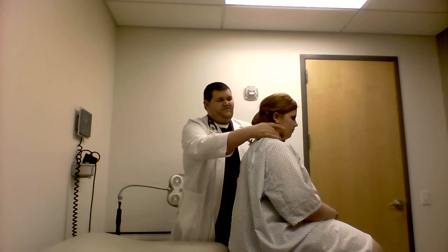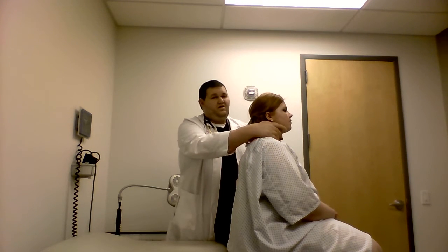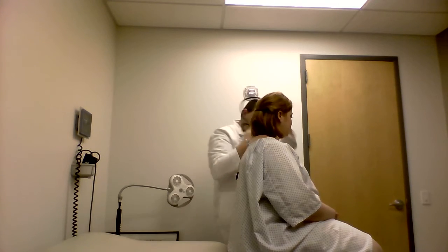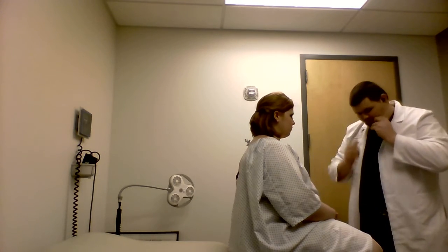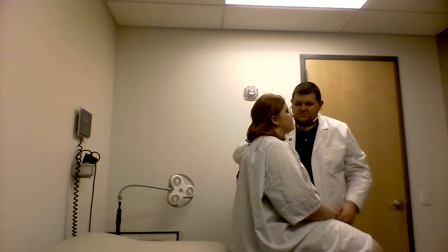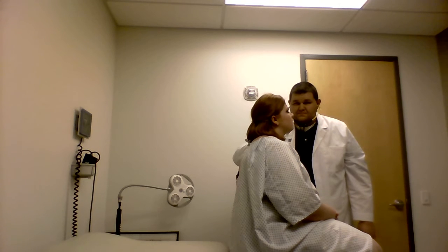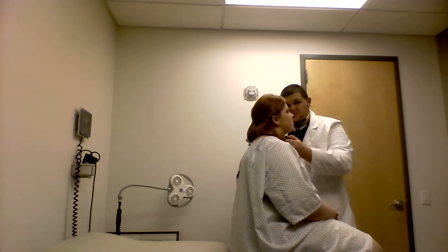Well, best appreciated from the back. So feel for the thyroid again. And can you swallow for me? Very good. All right. We're going to listen to the carotids using the bell. So just relax. We'll listen to the left side first. All right. And right side.